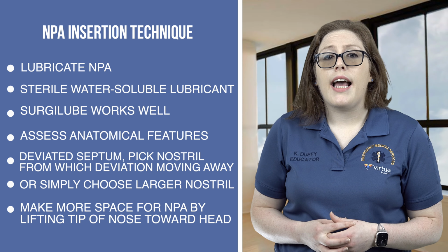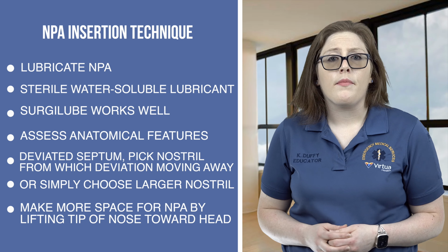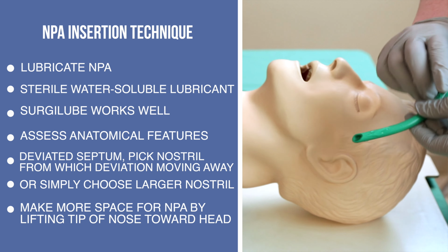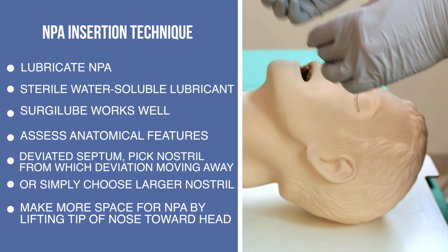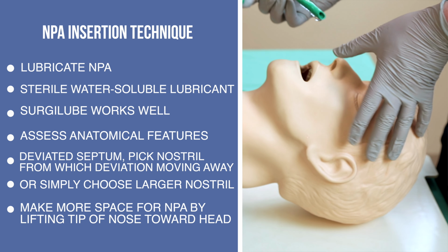Look at the patient's anatomical features carefully. Is there a deviated septum? If you encounter a patient with a deviated septum, insert the airway into the nostril from which the deviation is moving away. Another way to pick the proper nares is to choose the larger one.